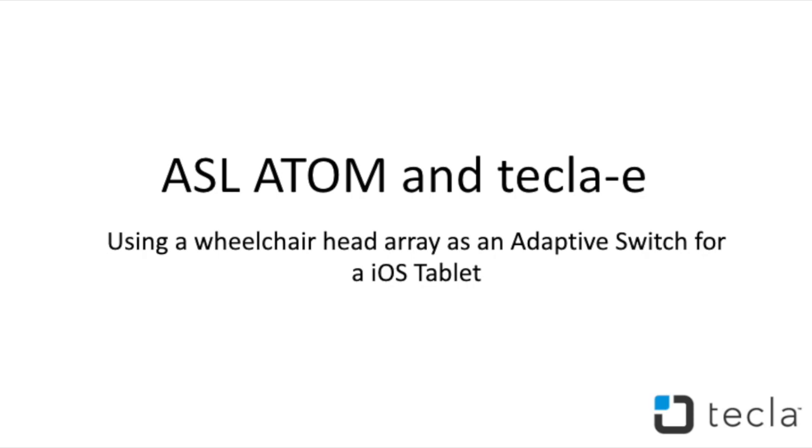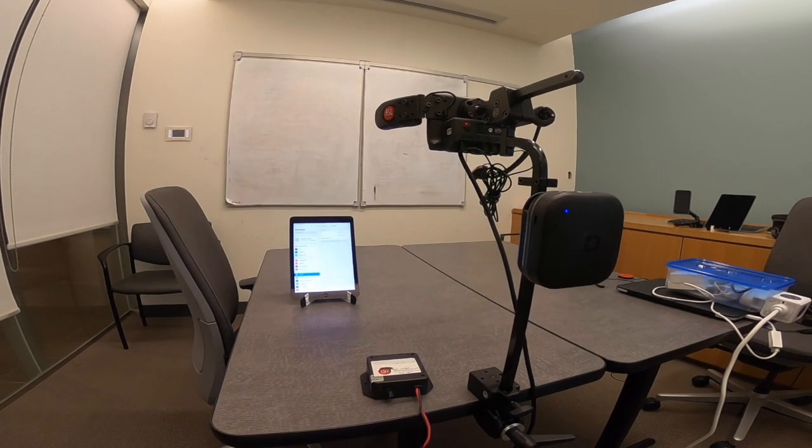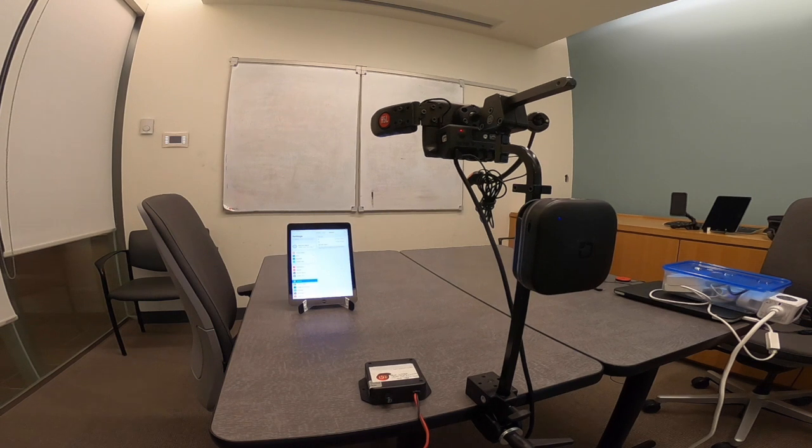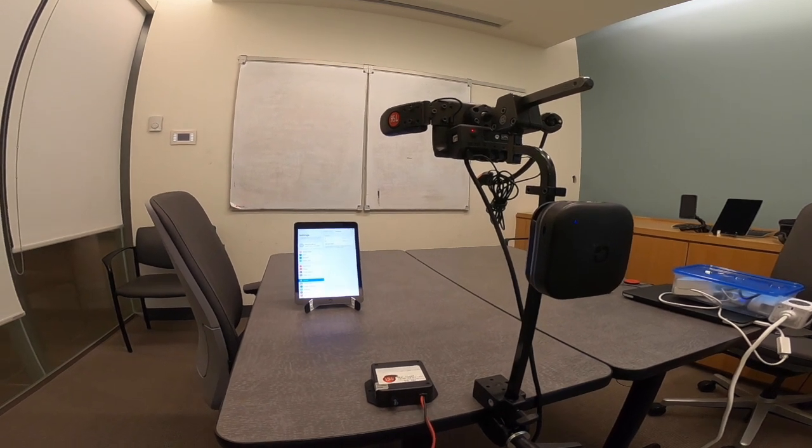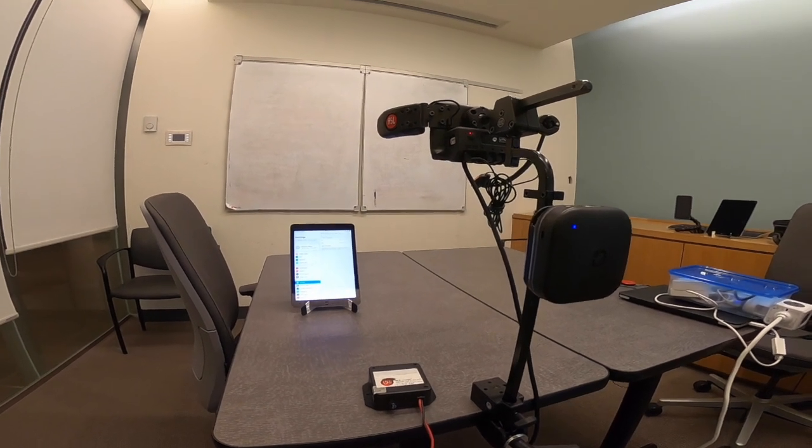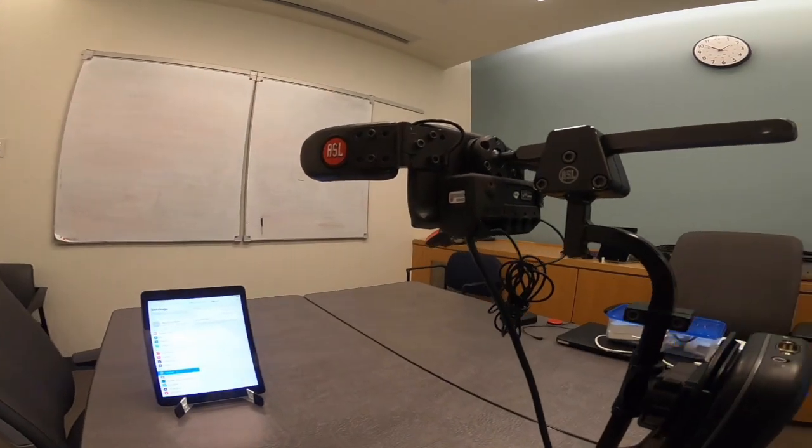Hi Tecla Insiders, thanks for tuning into our latest video. Today we will be showing you how the ASL Atom head array can be used as an adaptive switch to control your iPad.